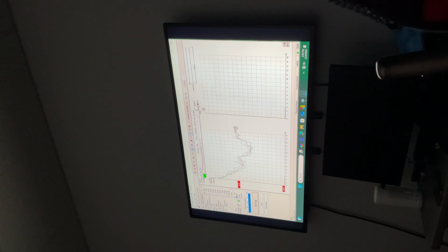So now do you see something emerging? Probably she has really good, probably this is 1, 3, 5. Do you agree? Sure. Yeah. If it is wrong, don't agree with anybody. You should politely disagree. So I was thinking this was wave 5, but it's 4 milliseconds. Then I realized it's not. So this one, 1, 3, 5. Do you agree? Sure.